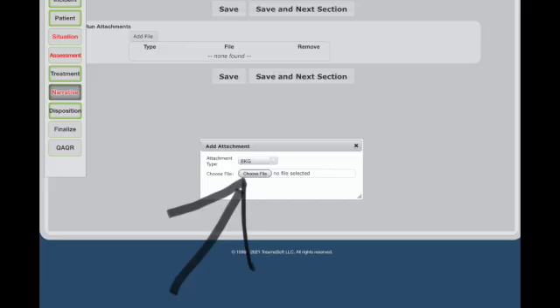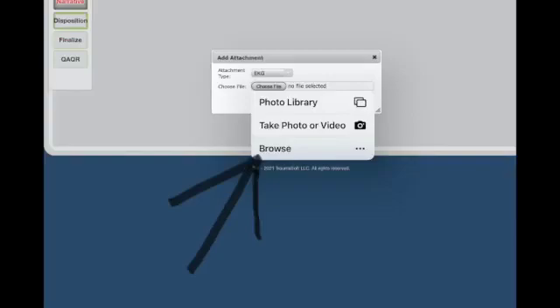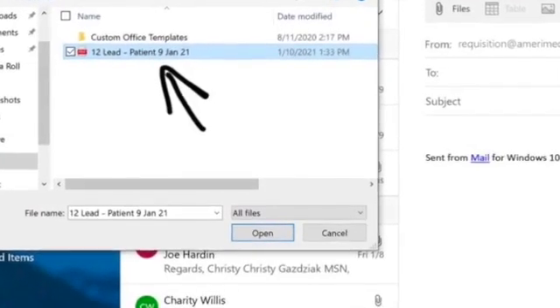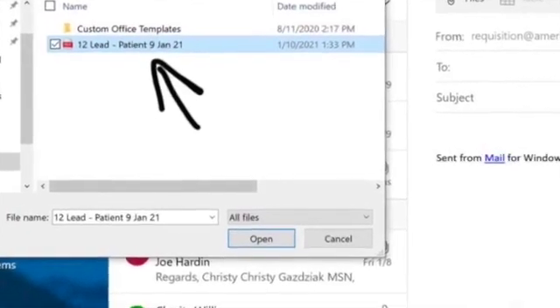6. Tap the Documents folder and tap to highlight the PDF of the patient's ECG record and tap Open. 7. Verify that the PDF is shown in the Attachment Files window.